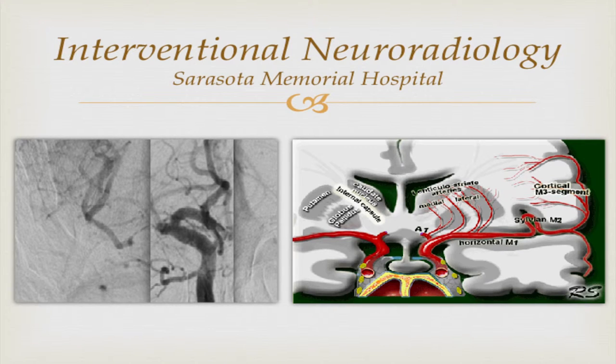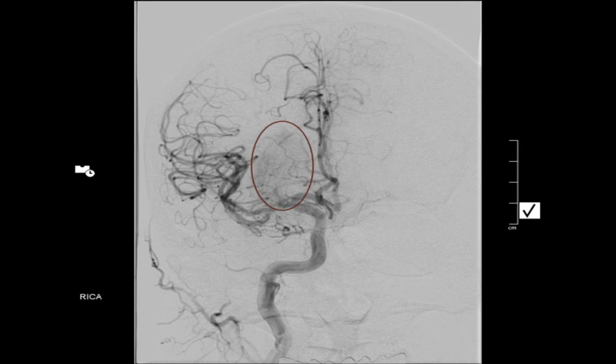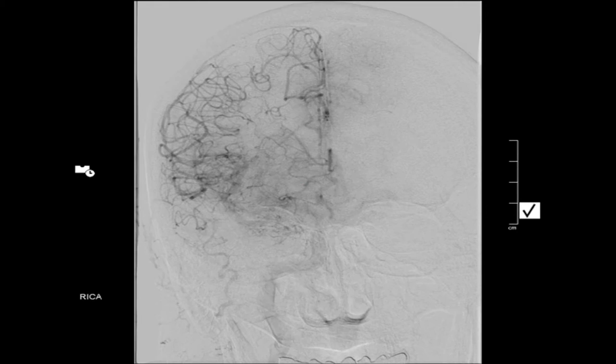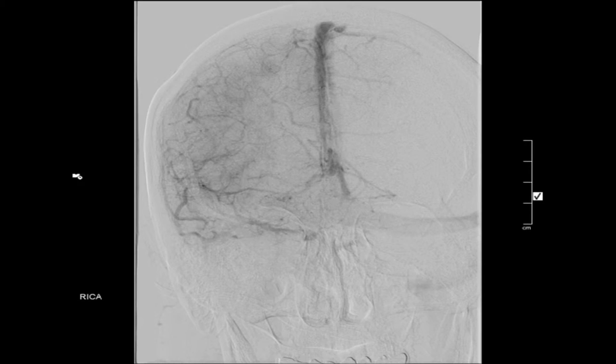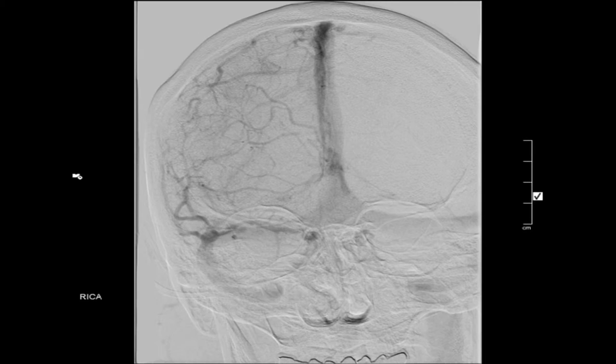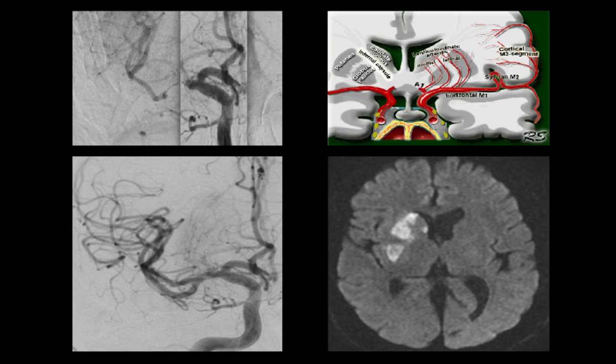So here's that clot. It's right there. So what's going on here? You can see it in the angiogram. Angiogram comes up, fills the MCA. Here's the perforators. So this is after I did the thrombectomy. And notice this whole area there is staining early. So the parenchymal phase is showing up. That's capillary. It's actually not even capillary. It's leaking. So the rest of it is arteries. But why is this staining there? Because he's got an infarct. So that's a permanent infarct that was infarcted by those perforators that didn't get any collaterals. The rest of his brain recovered great because we got that clot out and restored that reflow that was getting help from that reverse flow collaterals. But these perforators, they were left out in the cold.